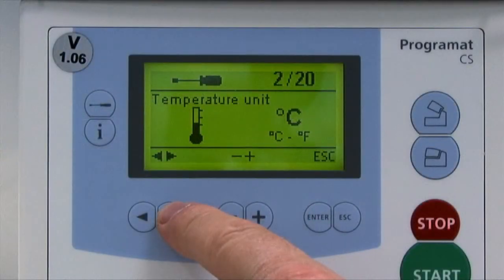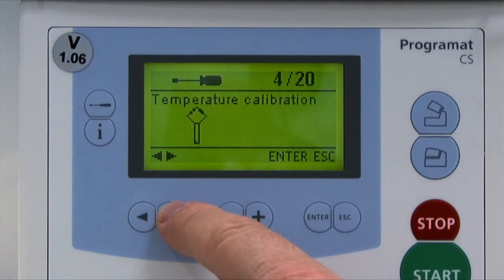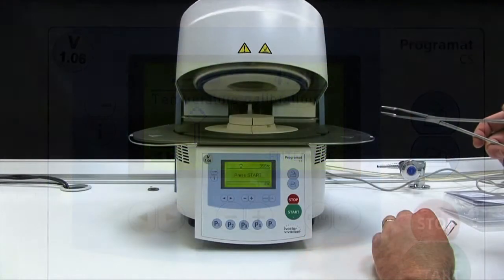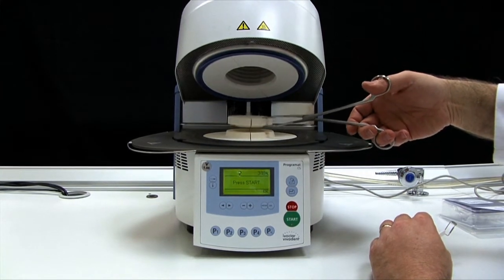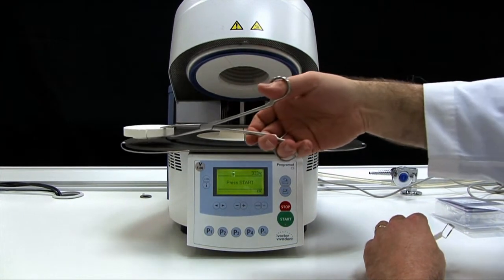To calibrate the program at CS, begin by selecting the calibration program. Remove the firing plate from the furnace using the furnace tongs and place it on the cooling rack.